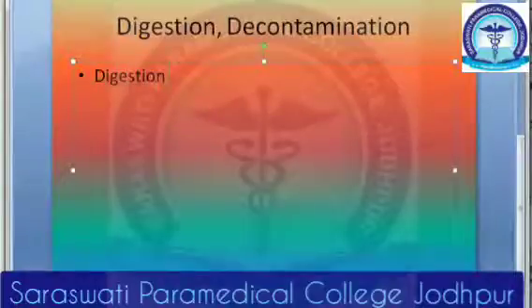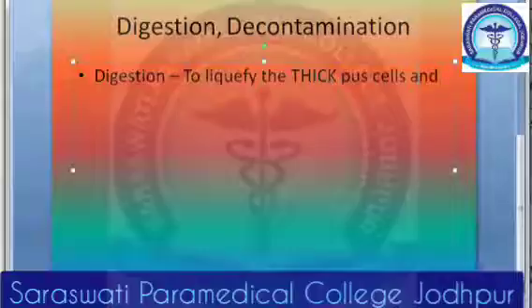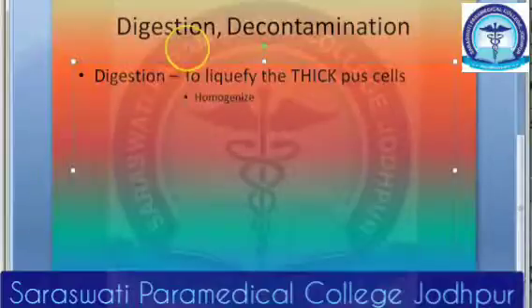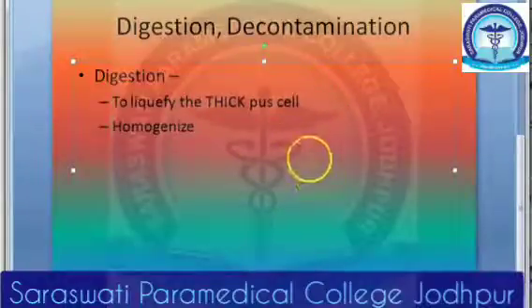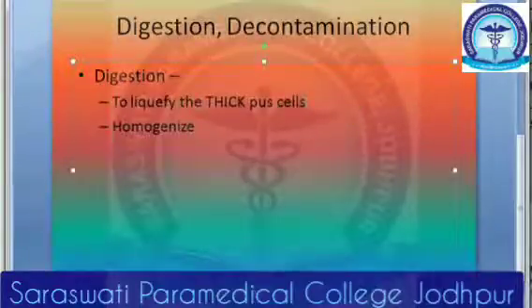In digestion, what you are trying to achieve: to liquefy the thick pus cells, and you also want to homogenize it. Okay, is this clear why you are trying to digest it?